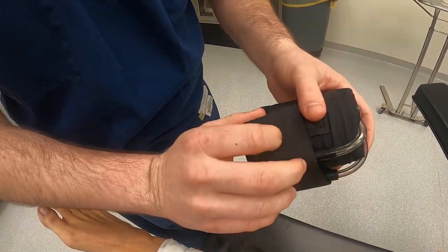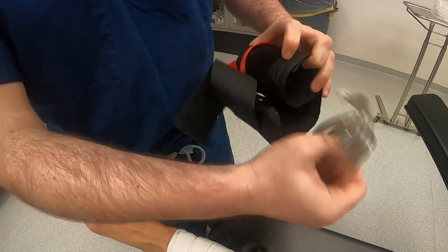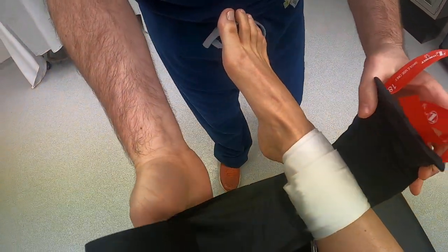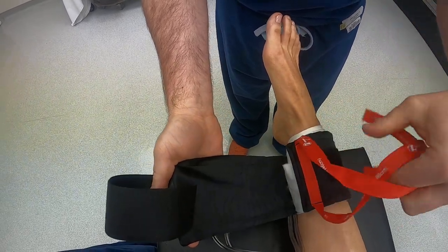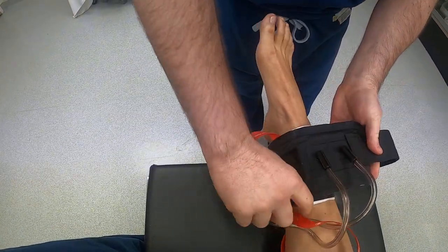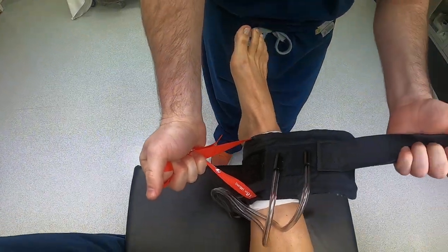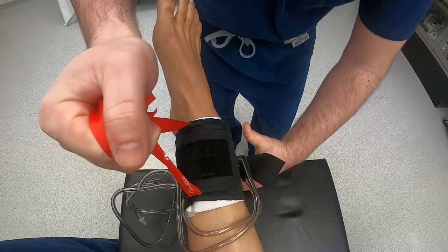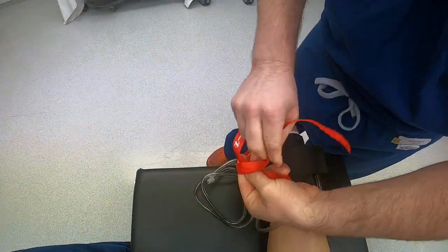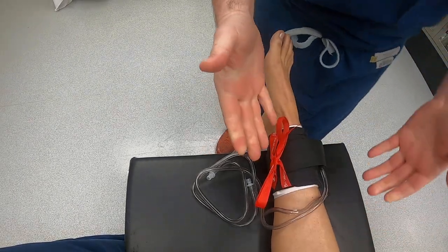Applying the tourniquet requires some coordination — it's a big velcro assembly. Open it all the way into a long band and take out the tubing. Wrap the long band around the ankle, colored portion going down first, then the second portion goes across. Use the ribbons to get a good grip, pull the velcro as hard as you can with the other hand, swing the velcro around and attach it all the way around, then tie the ribbons around to keep the velcro secured. Now you have an applied tourniquet.